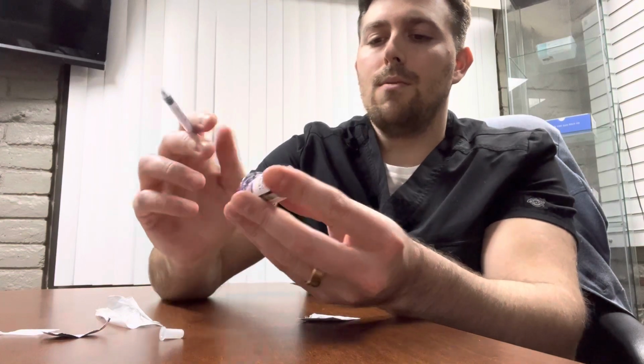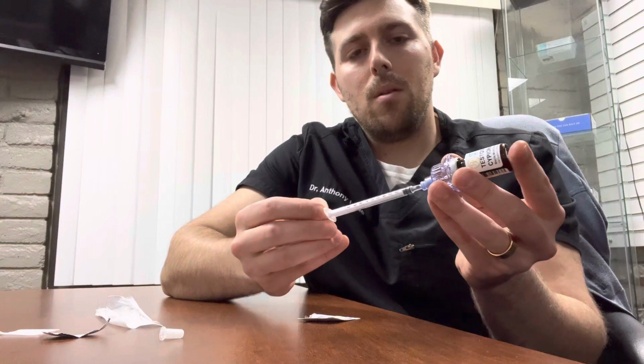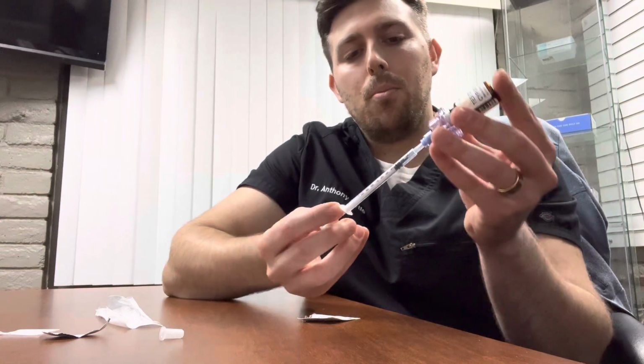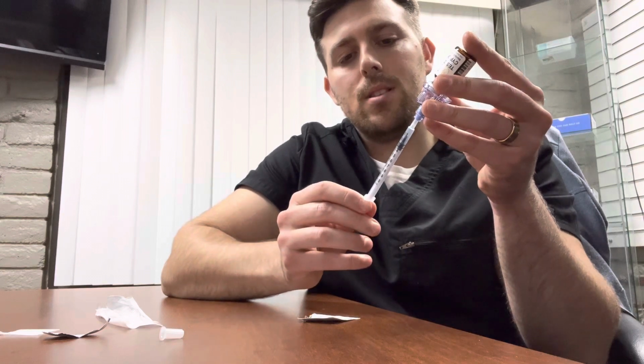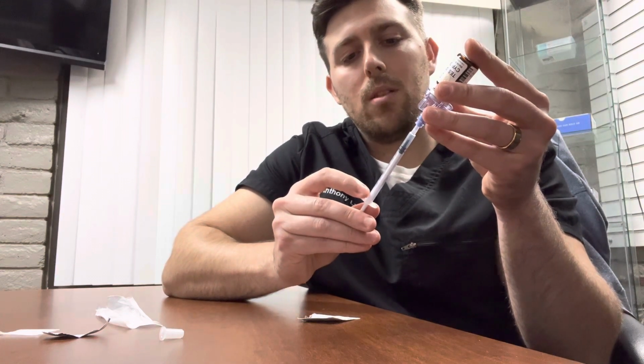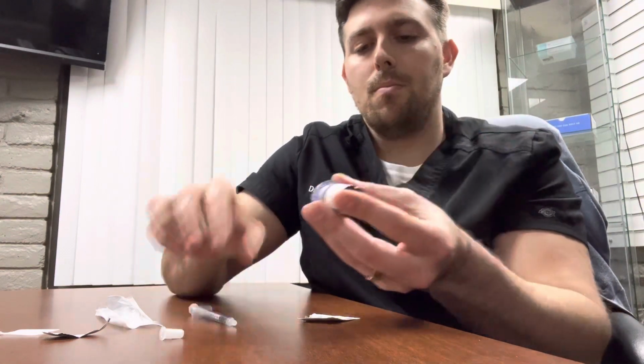That's what I do. I invert the vial, and then I pull on the 1 ml syringe and pull the substance into the syringe at the correct dose. If I have to put a little bit back, I put a little bit back in. Once I'm there, I can just pull right out, and I have my correct dose in the syringe.